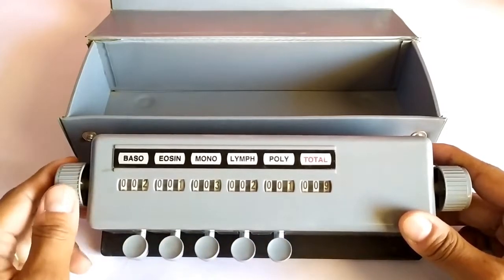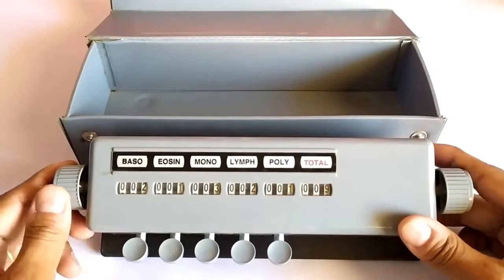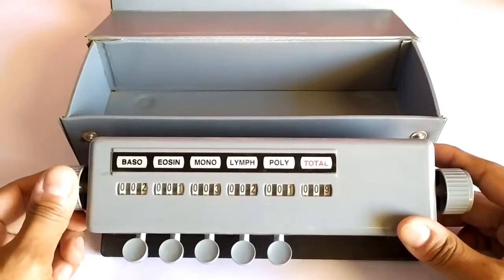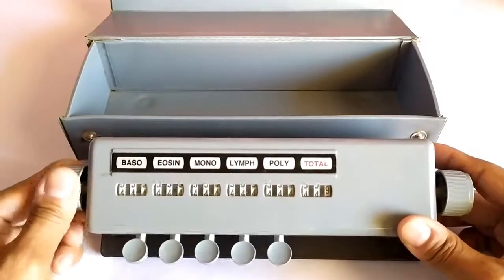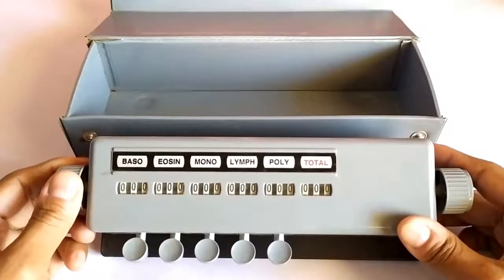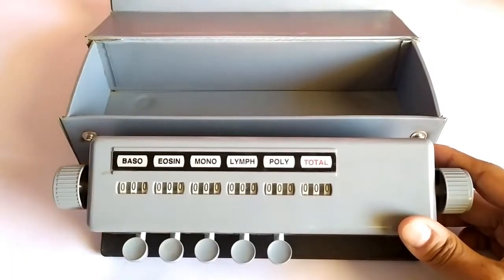You can position the 5 fingers of one hand on the 5 keys while looking through the microscope and proceed smoothly with the counting, although it requires a bit of practice and repetition to familiarize yourself with which finger rests on which cell type key. When a counting session is complete, you can set the counter back to 0 by rotating the 2 knobs located on each end of the counter in a clockwise fashion, until the rotating numeral rings of each slot are at 0.